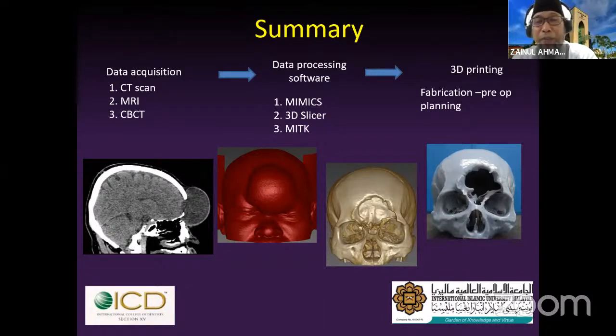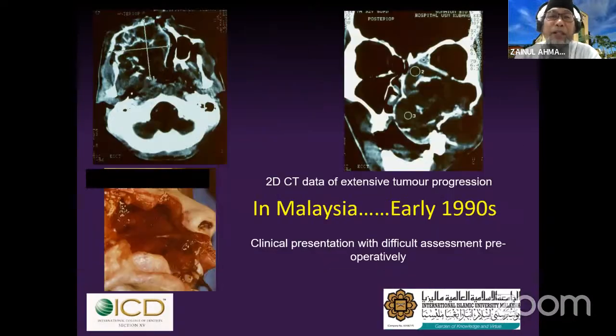You can use this software, and also you need to have some 3D printer to fabricate. You can transfer the data from DICOM into STL, the language used for 3D printing, and can print any of your pre-operative model before you go for surgery or for some surgical simulation.